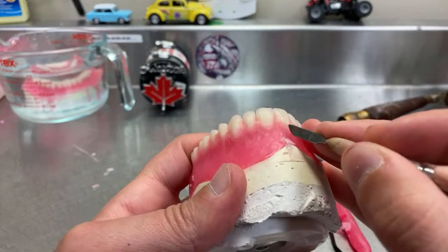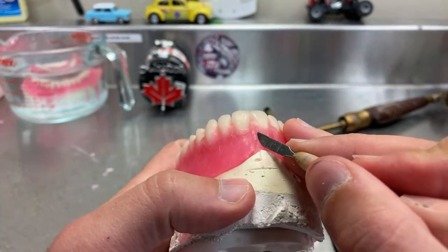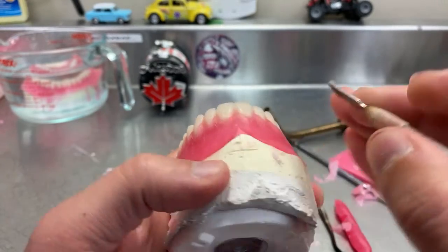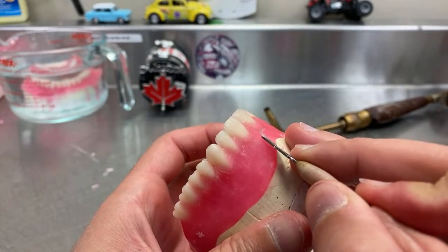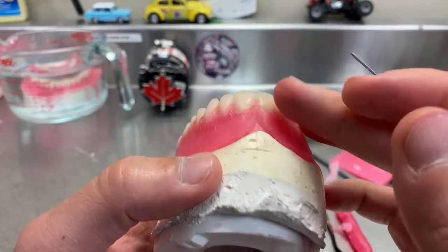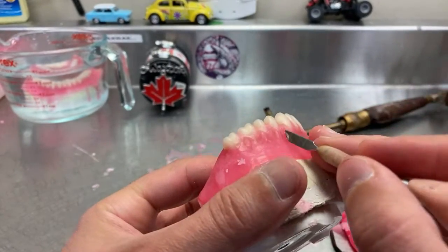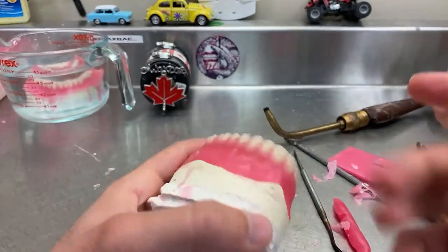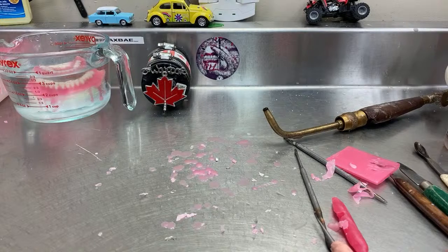And then you have the frenum here. So basically what you want to do for the frenum is press here to form it, and press here to form it, and then what do you have in the middle? It will look good after you flame it. All right, so now that all of that is done, we clean it up.